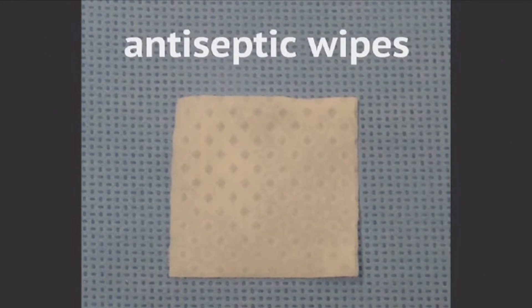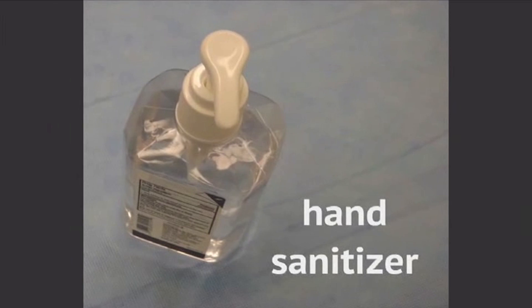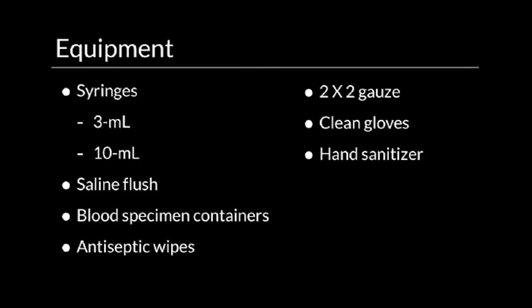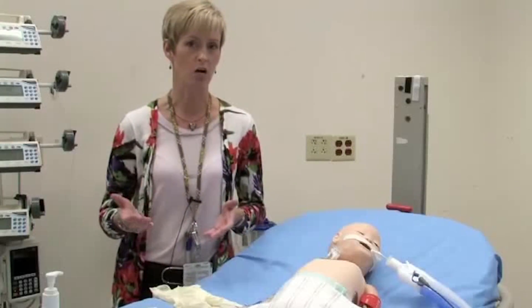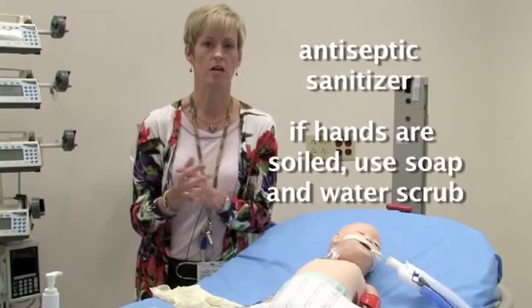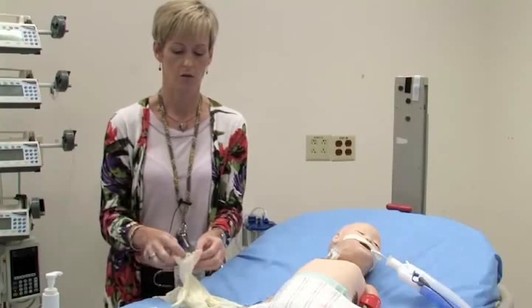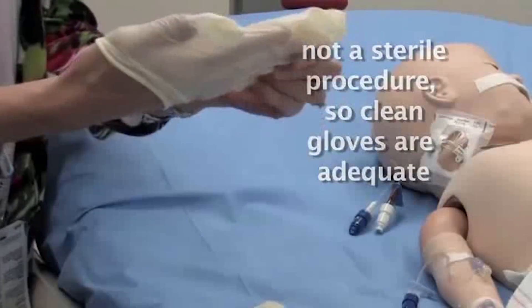Additional equipment includes: antiseptic wipes, 2x2 gauze, clean gloves, and hand sanitizer. To begin, we always start by explaining to the patient if it's age appropriate, and cleaning our hands using an antiseptic sanitizer. If hands are soiled, soap and water scrub would be used. After explaining to the patient, we get our equipment ready, starting with gloves. This is not a sterile procedure, so clean gloves are adequate and there is no need for a mask.